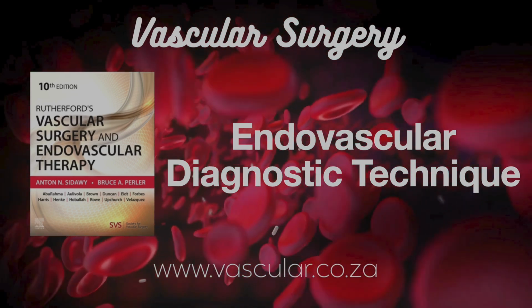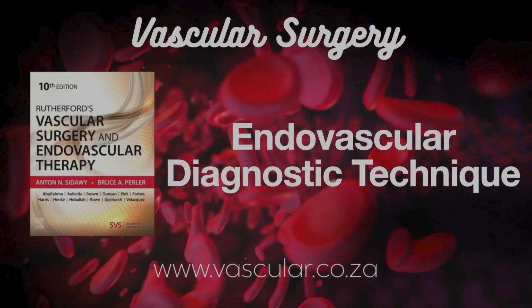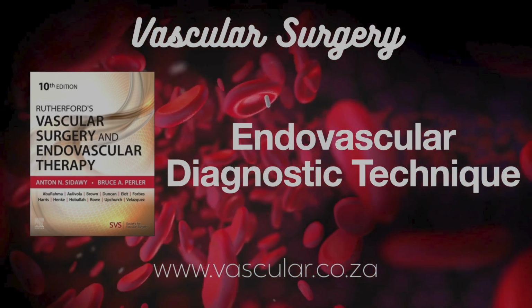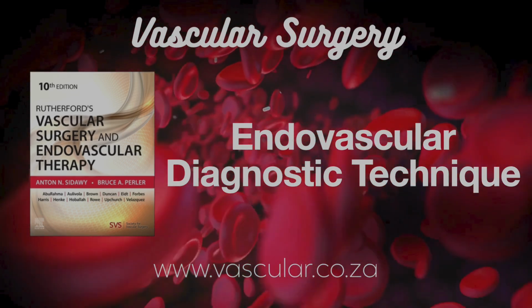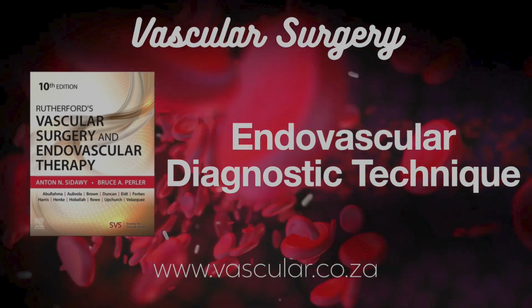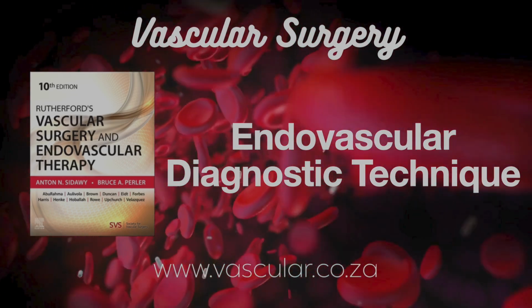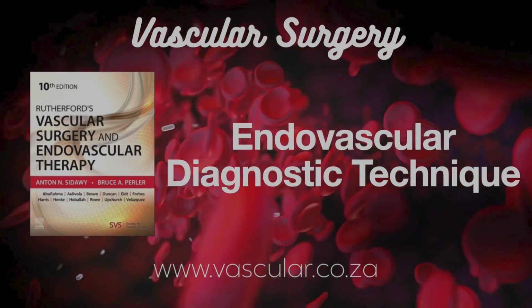Let's start with non-selective, like a pigtail. Exactly. Omniflush or pigtail catheters are classic examples, designed for injecting a good volume of contrast into big vessels, aorta, vena cava, usually used with a power injector. Why the side holes? They have multiple side holes near the tip. Helps disperse the contrast widely, evenly, reduces the jet effect you'd get from a single end hole, which could damage the vessel wall. And the curve? The curve also helps disperse contrast. And that pigtail shape is handy for hooking the other side, the contralateral iliac, after you've imaged the aorta.